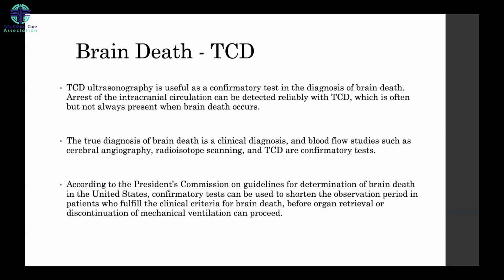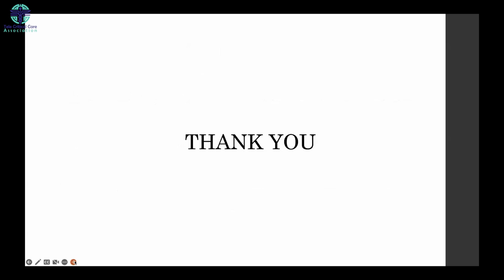So this is all about the use of ultrasound and its various applications when we have a patient with increased intracranial pressure. I won't say that with transcranial Doppler alone we can diagnose brain death, but definitely we have to do clinical examination and all. It can help us as an ancillary test for diagnosing brain death by using transcranial Doppler when the ICP is very high. Thank you so much, and I'll be happy to take some questions.